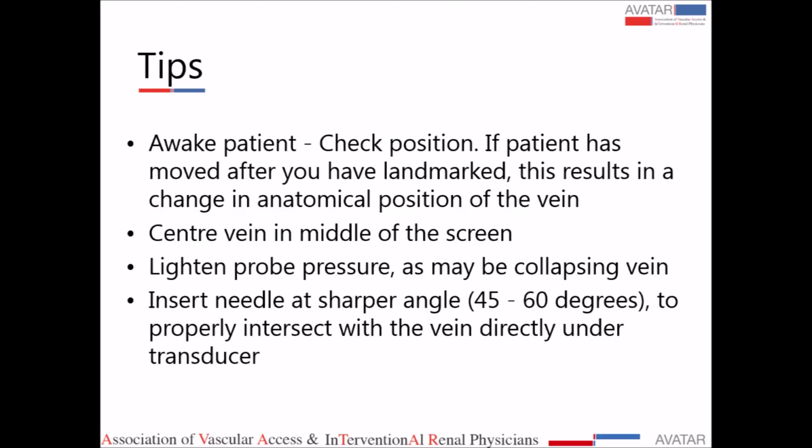You have to centralize the vein in the middle of the screen and not at the side of the screen. Whenever you are dealing with the vein, you should not push the probe forcefully, because it will collapse your vein and you will mistake the artery for the vein. So you should lighten the probe pressure, and insert the needle at a sharper angle of 45 to 60 degrees rather than at 90 degrees or a flat angle. Basically it gives you a better view of the needle.